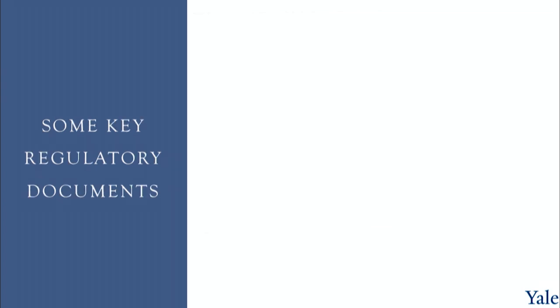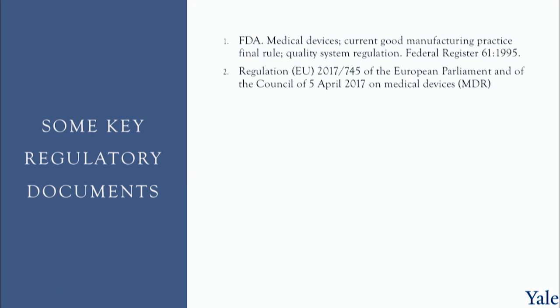So we'll end this lecture by giving you a list of documents that we'll use as a basis for the remainder of this class. The first is a list of key regulatory documents. These are the original regulations. This is the US regulation, the Quality System Regulation of 1995. This is the Medical Device Regulation of the European Union. This is the 2017-745 that just came into effect.